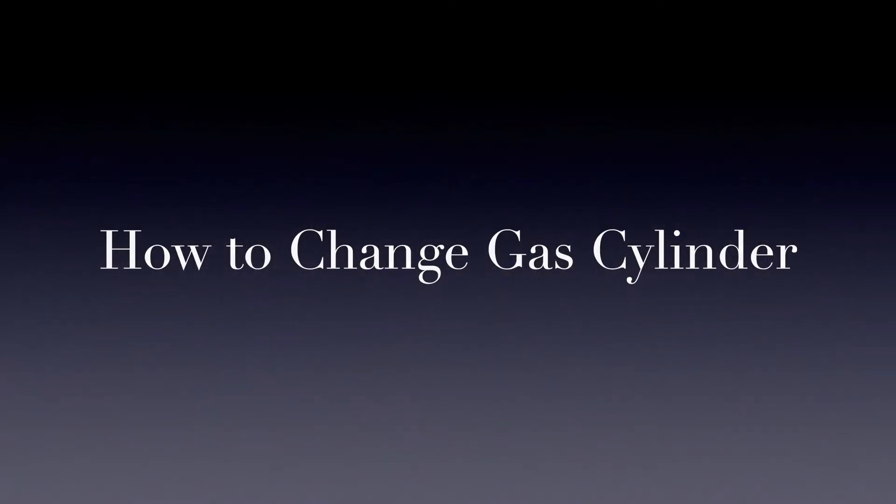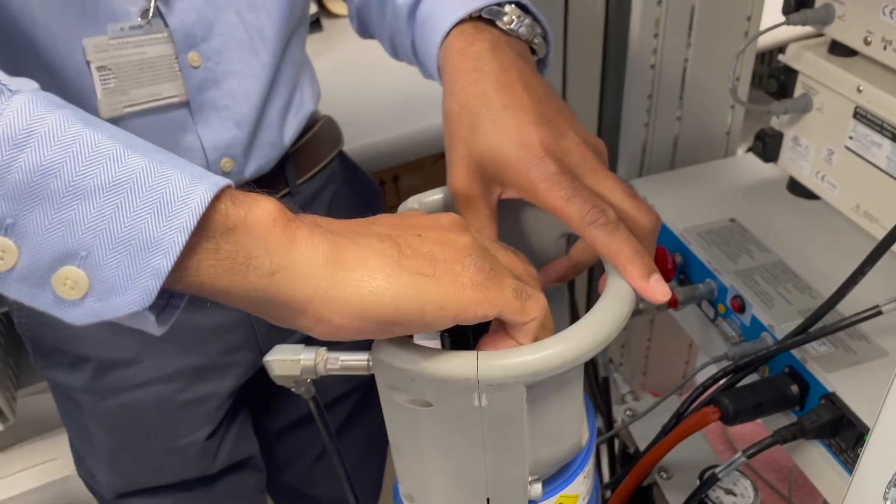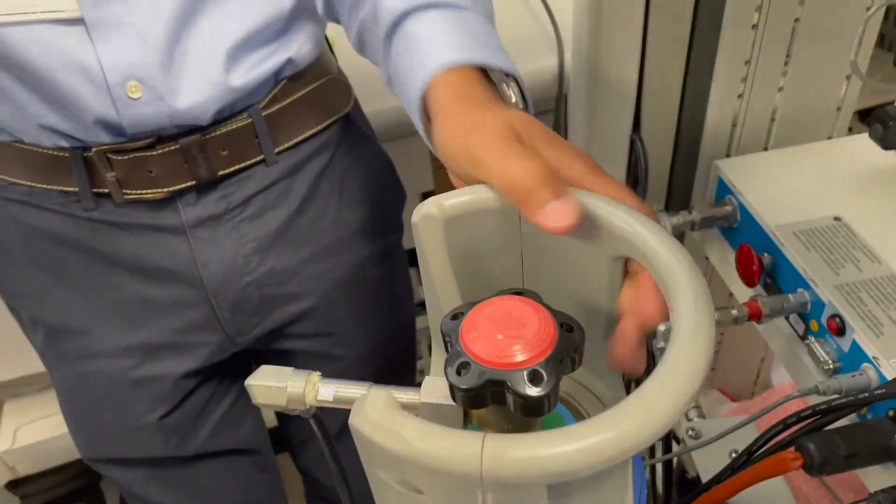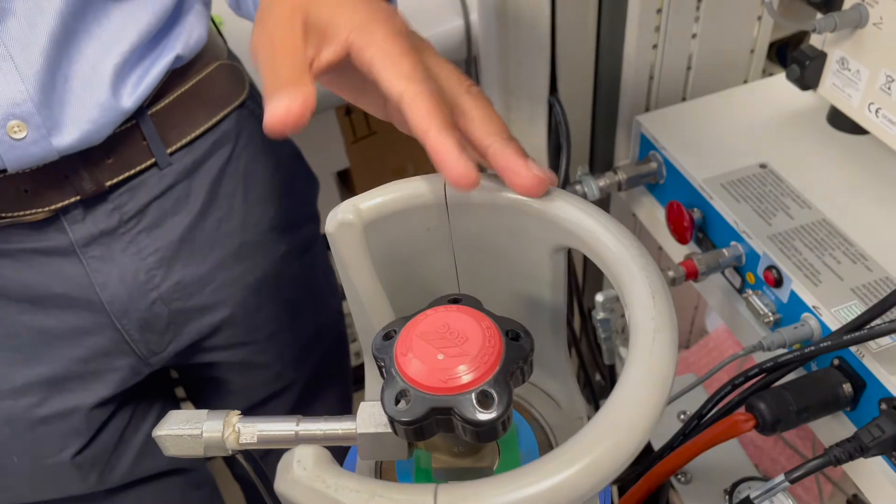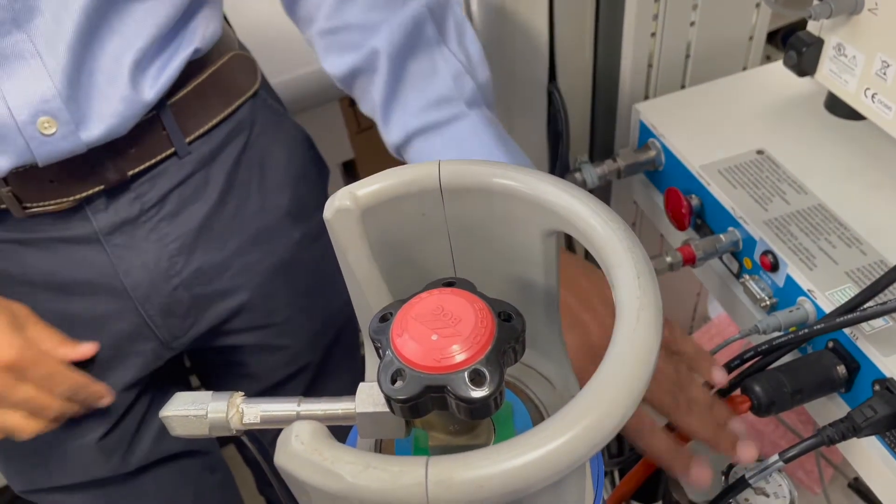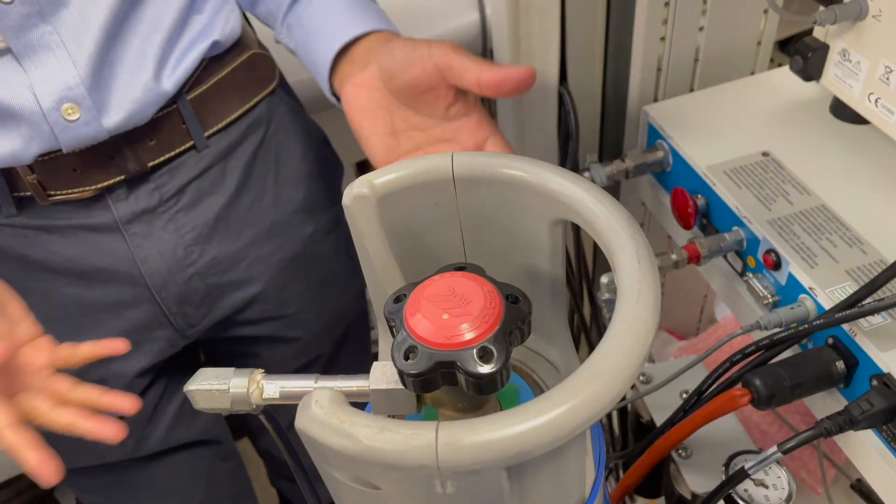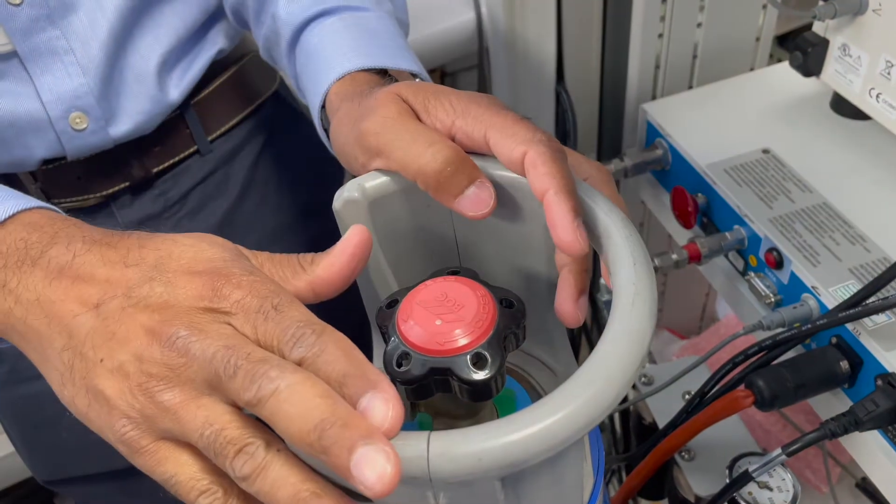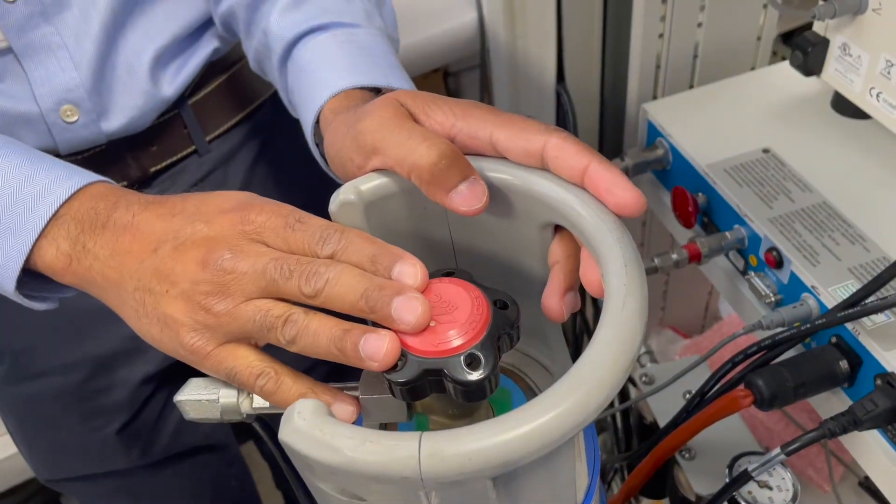First thing you're going to do is turn the gas off because the machine, let's say for example you're doing it in theatre, surgeon says not working, you have a quick look at the pressure, the pressure is below 800, you want to change the gas bottle. The gas bottle at that point will be opened, so just turn the gas bottle off.